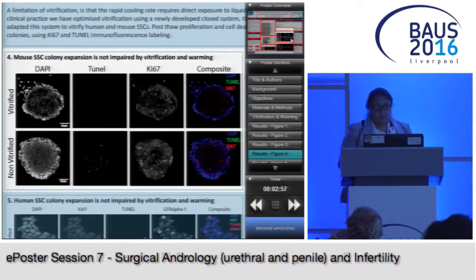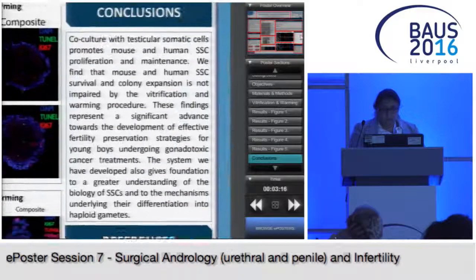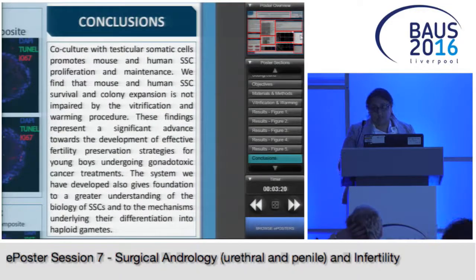What I found was that TUNEL staining, which is a marker of DNA damage, was low, and Ki-67 proliferative marker was good. So both in the human and in the mouse colonies, I got a good cell viability rate after warming. In summary, co-culture with testicular somatic cells accelerated SSC proliferation and their maintenance in culture, and vitrification seems to be a good way of cryopreserving these cells effectively, and it doesn't seem to impact on cell expansion afterwards. So I think altogether it's quite a nice step towards possibly bringing this strategy to clinics of the future.